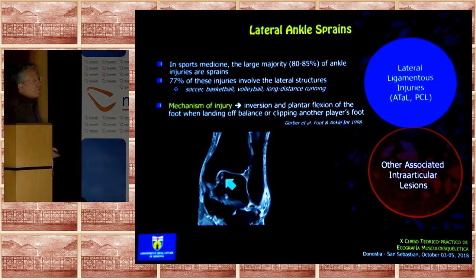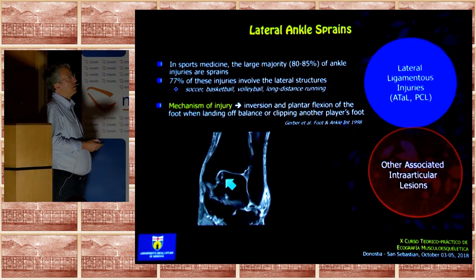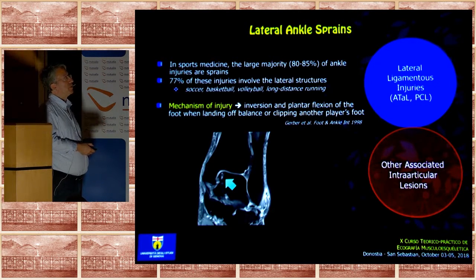And different from the knee, ultrasound has a great role to image the ligaments in the ankle. It may manage the problem without asking help from MRI.